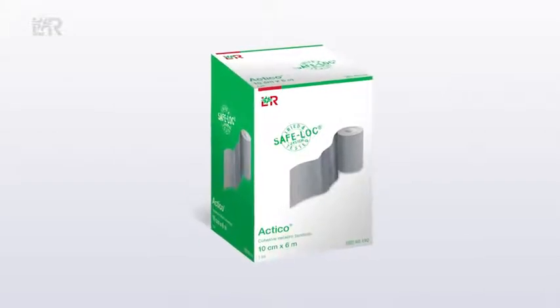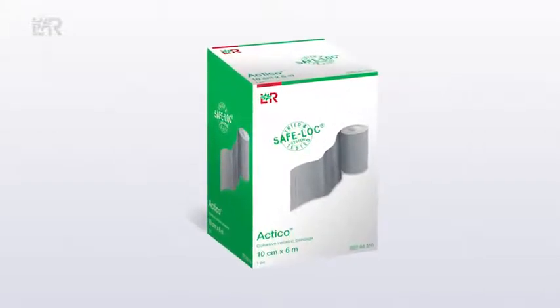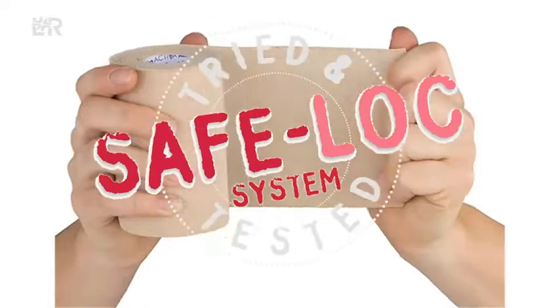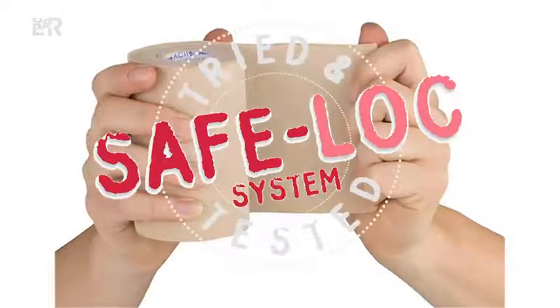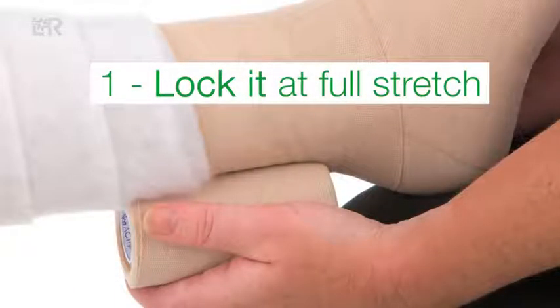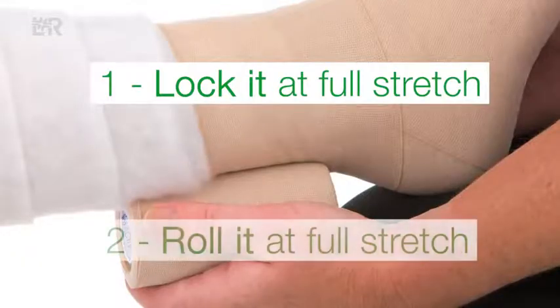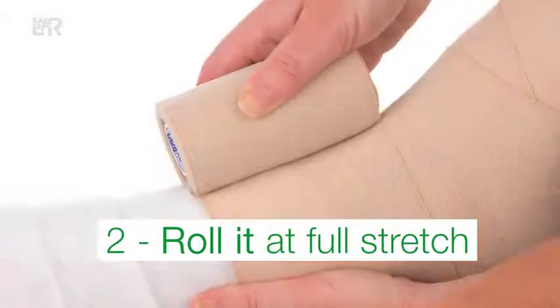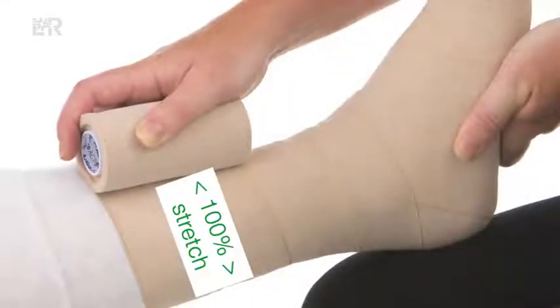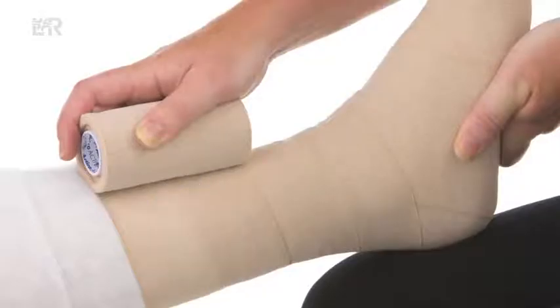Actico has a built-in feature, the SafeLock system, which delivers a consistently safe, accurate and easy application using the lock and roll method. You need to lock the Actico bandage out at full stretch on the limb and then roll it at full stretch around the leg in a spiral. Actico should be applied at 100% full stretch and always close to the limb with a 50% overlap.